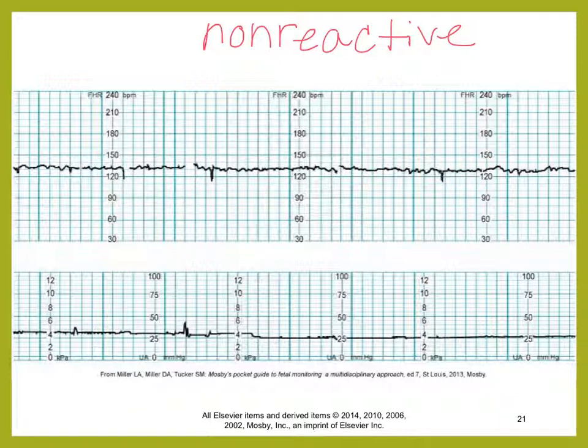What makes a non-reactive test? The test does not demonstrate at least 2 of the qualifications, the accelerations in that 20-minute window. So you can see in this case, what are we looking for? 15 above baseline.